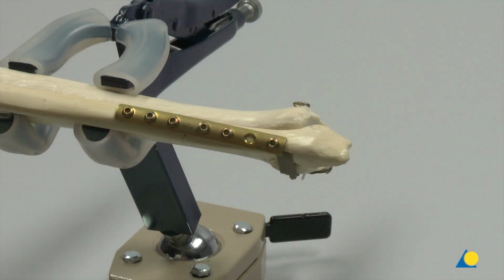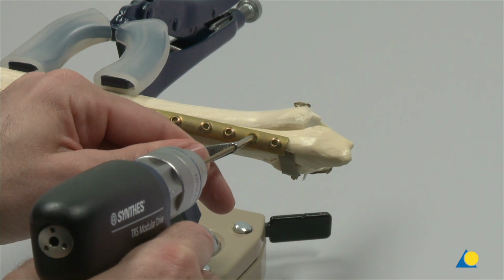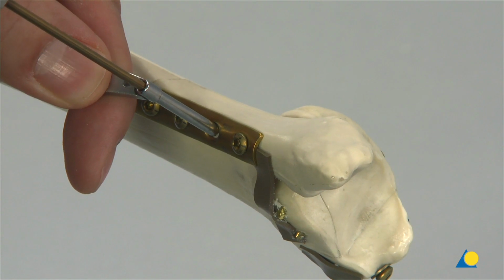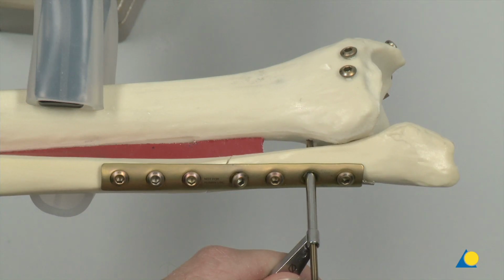Ensure that the syndesmosis has been reduced properly. A K-wire or pointed reduction clamps can be used for this. Using the 2.5 mm drill bit and the appropriate drill sleeve, the 3 cortices are drilled at a 30-degree anterior angle and parallel to the tibial plafond.